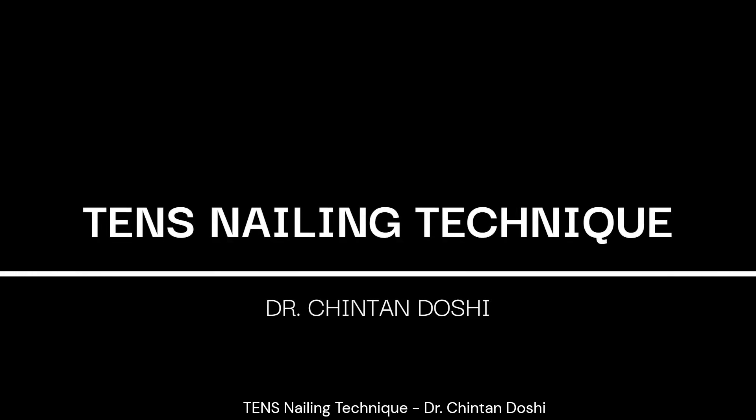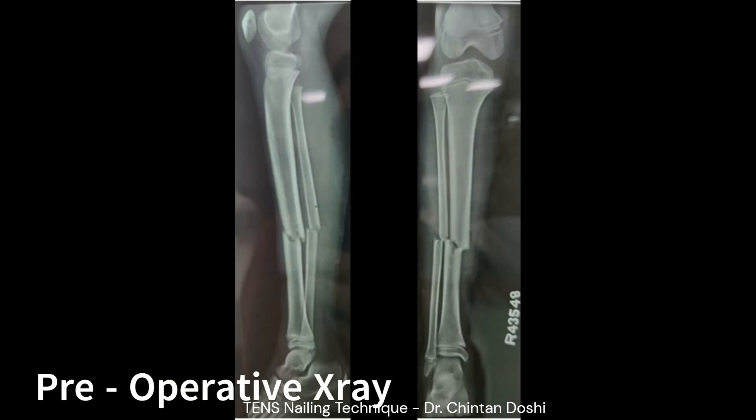Presenting the Titanium Elastic Nailing Technique for Tibia Fracture by Dr. Chintandoshi. Here is an X-ray of a 10-year-old boy with a tibia-fibula unstable fracture at the same level.